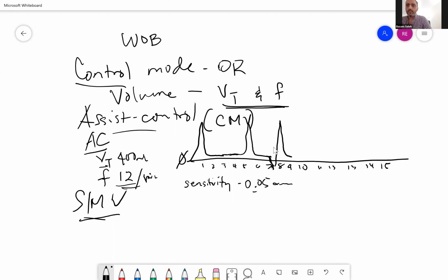With me so far? So again, if the patient breathes in between ventilator delivered breaths, initiating their own, they can do that. However, they cannot determine the tidal volume. The vent determines it because it's on AC mode. That's what it's supposed to do. The patient can initiate the breath, and they will be given a breath. That's why it's called assist.